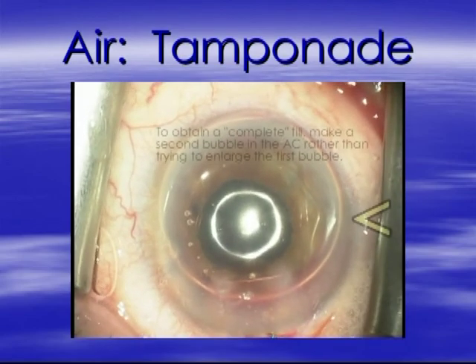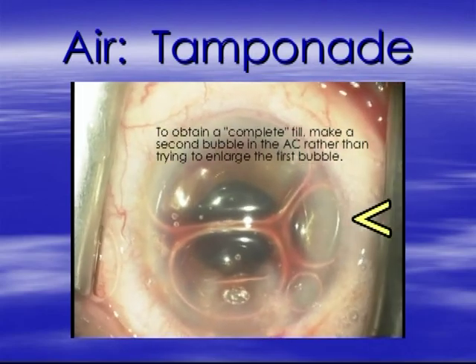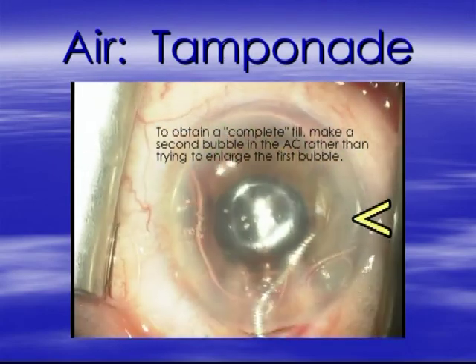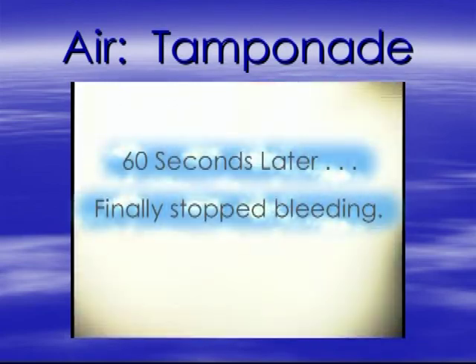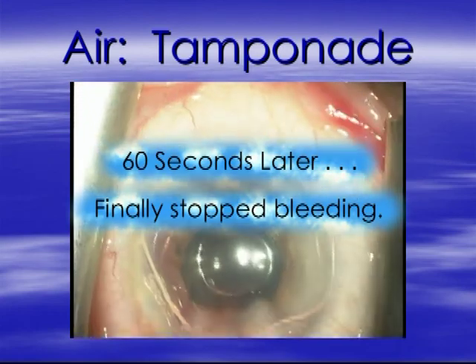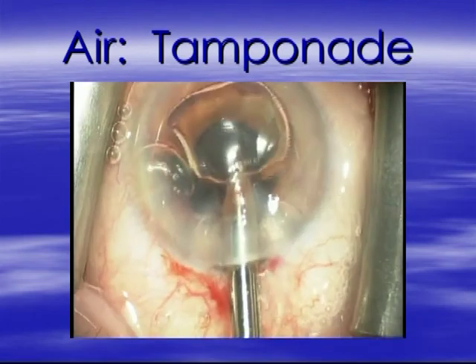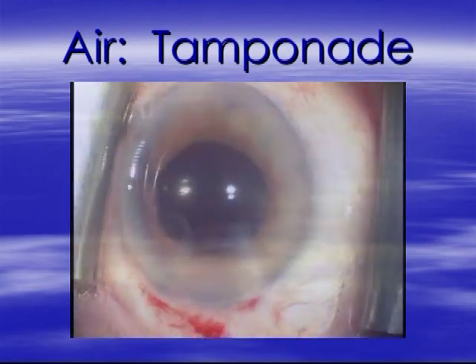As long as the vessels are non-pathologic, in other words, as long as these are normal anterior chamber vessels, be it in the iris or in the chamber angle, the bleeding will stop, and this is true whether patients are on anticoagulants or not. So we've had this occur in patients on Coumadin, on warfarin, Lovenox, heparin, Plavix, aspirin, ginkgo, you name it, and it is very effective at stopping the bleeding, and certainly the time spent here is far better than clinically having to deal with the hyphema postoperatively.